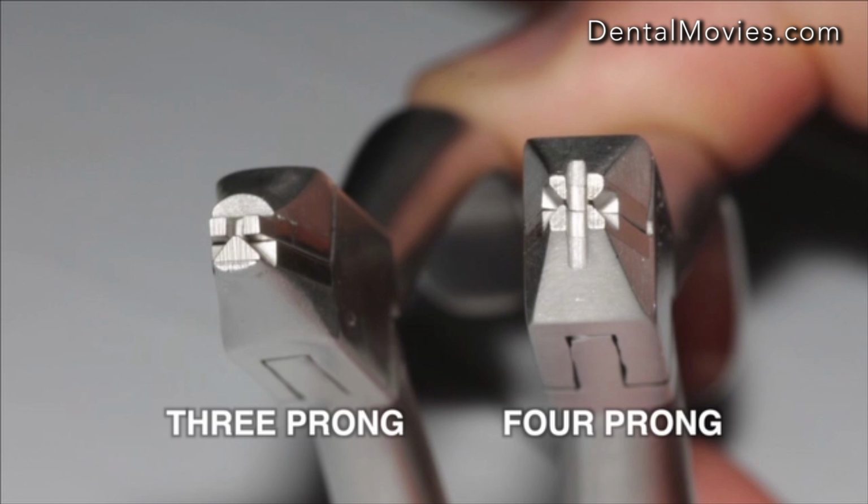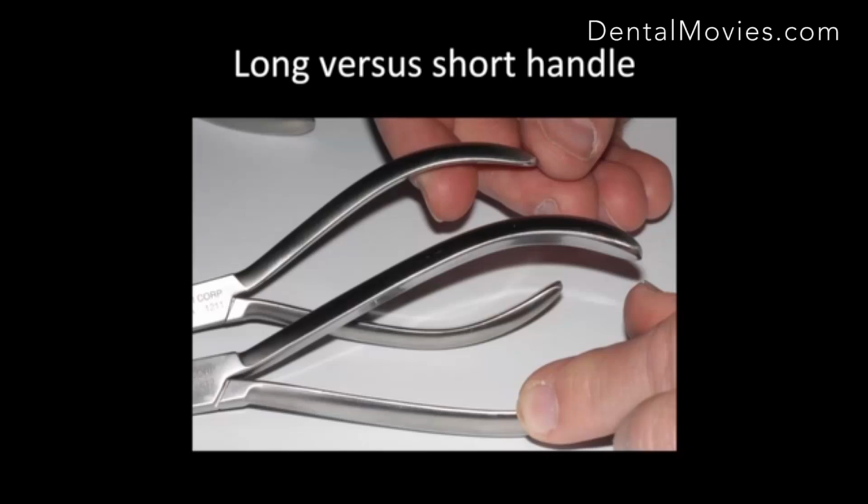The 4-prong, you come along, you pick up the hook, you go straight to the wire, you go crimp and bang, it puts it on there. For elastics, for surgical hooks, you know. As far as handles, always go for the long handles, because if you're doing intraoral stuff, you need to get down the back there.